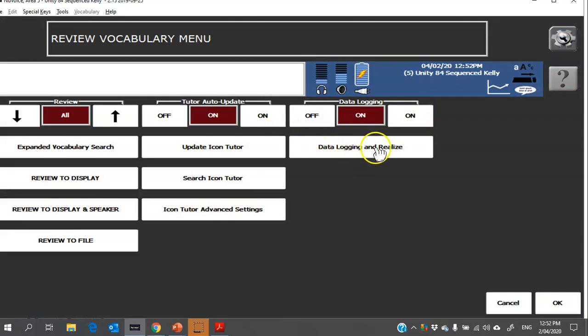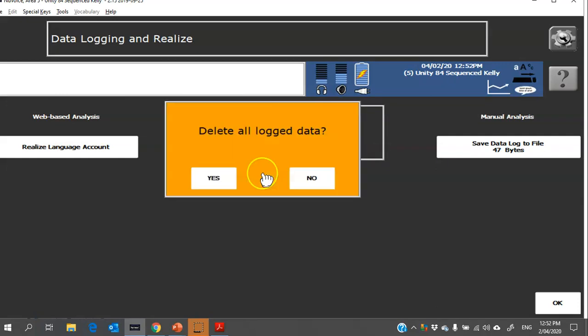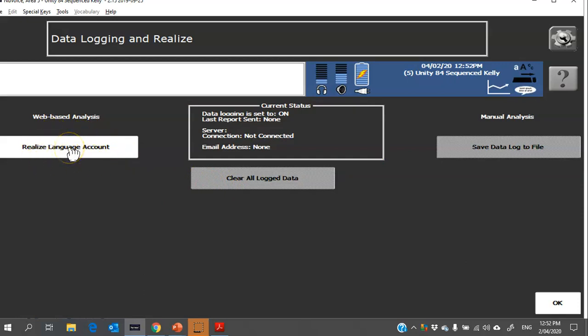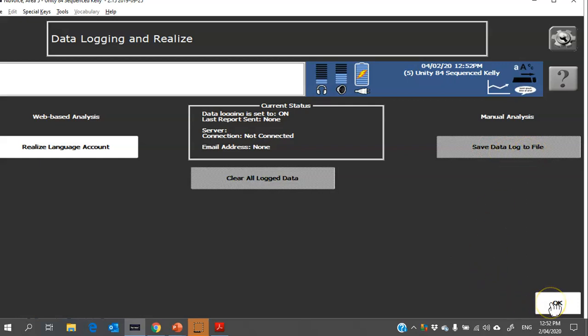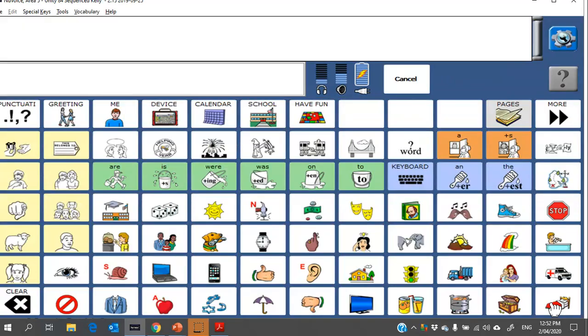From there you can head into data logging and Realize. You can clear any data that might already be there at the start of the trial. You can log into your Realize account. If you're not sure what that is, please feel free to contact us. And at the end of the trial, once you have a data log, you would click on here to save the data log and you can then export that out onto your USB stick. The main thing is make sure it's turned on before you start the trial so that you've got all that vocabulary and device use being collected.